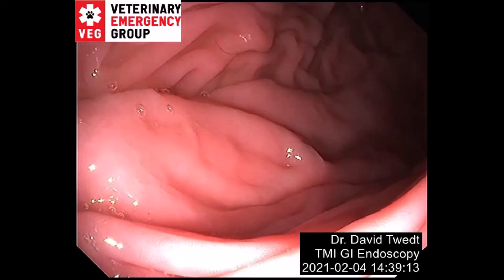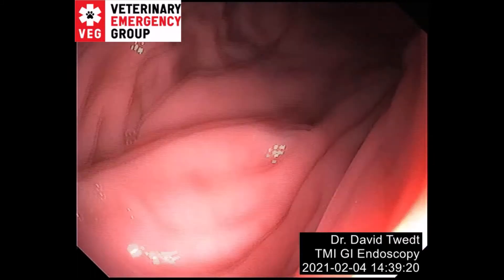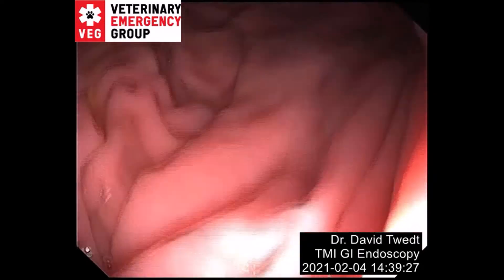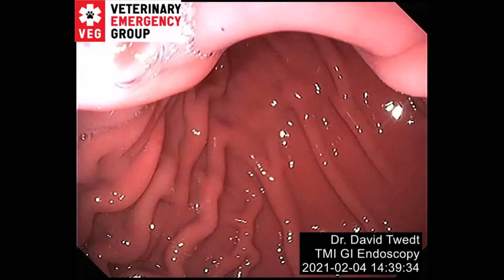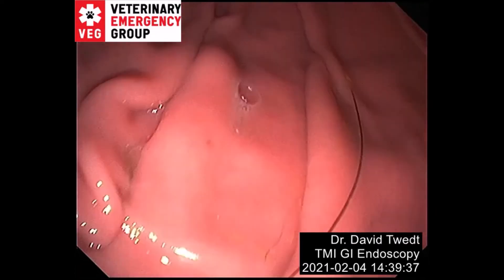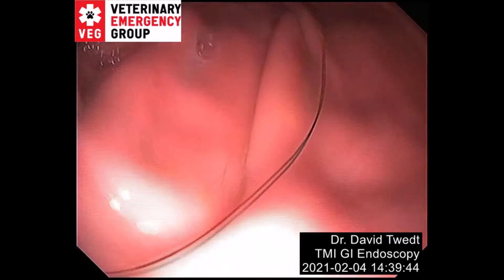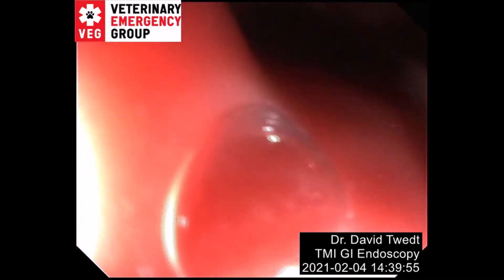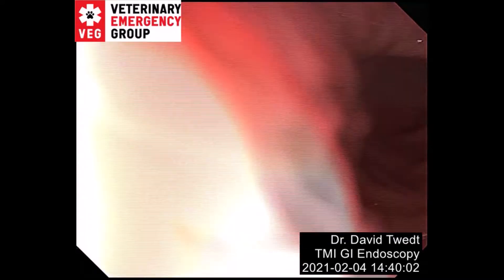This is what it actually looks like — you want to get into the habit of being able to recreate this view. This is down the greater curvature. If you follow all those rugae folds, they will naturally lead you to what looks like a floor that's about to take you into a cave. So as I'm heading toward the floor, in my mind I'm saying to get into that cave I will need to look up — big knob back. So as I'm advancing and bringing the big knob back, this is exactly what you did to retroflex and look at yourself.